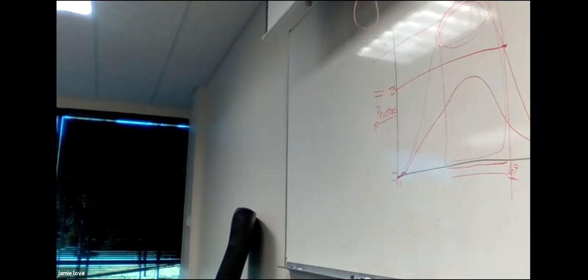That's all I'm looking at these spectrums for, is to show you the graph for people that are visual, to see what we're talking about. There's a table that shows it too. I like the table. That's how I learn the chart. I don't do the graphs too much, but they do show it for people who are able to learn that way. We have these charts in books in the X-ray departments, but we don't ever look at them.